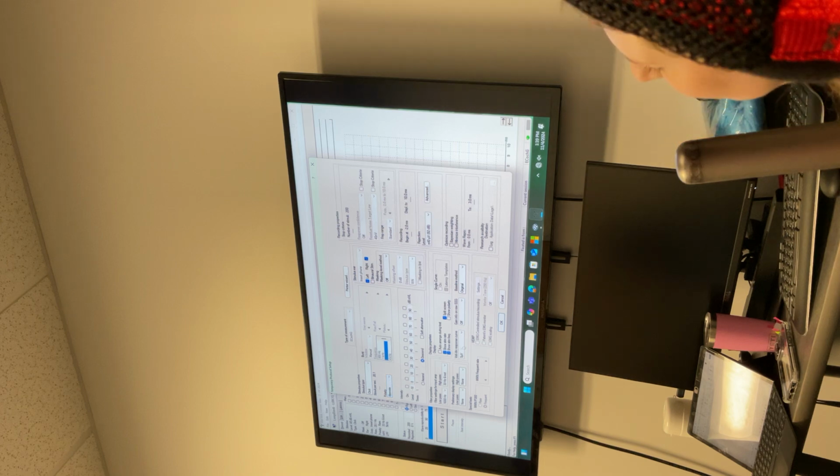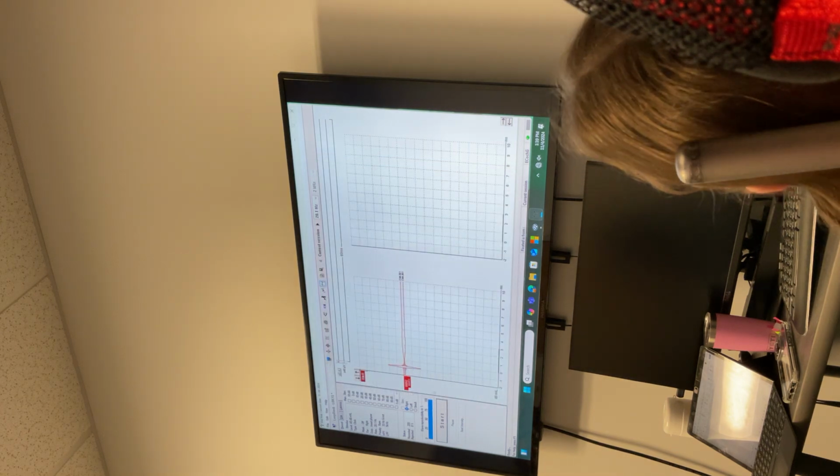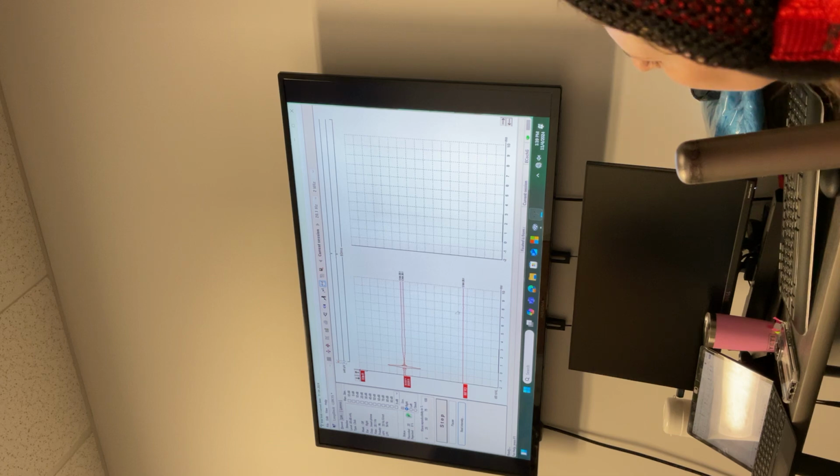It will cancel out. Alternate. So one stimulus will be rarefaction, the next is condensation, rarefaction, condensation. When you play them together, it will get cancelled. You'll see like a flat line.